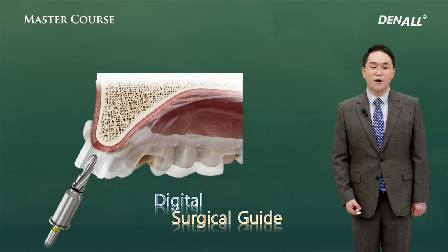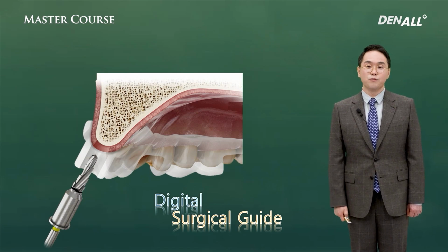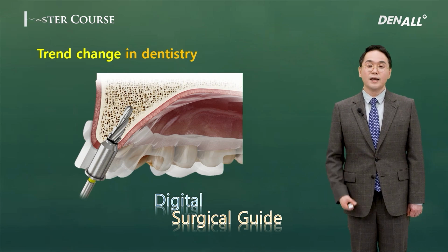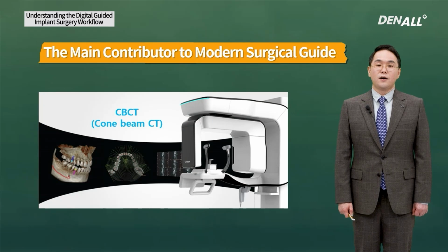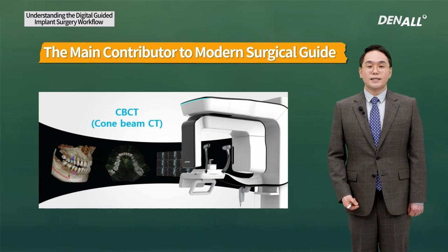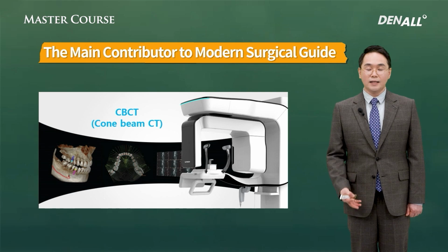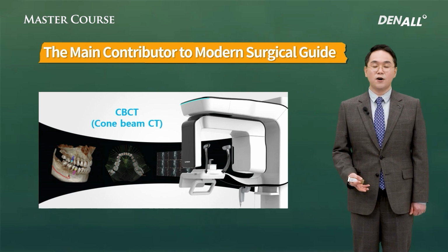Therefore, recently, as digital becomes the big trend in dentistry, digital surgical guides and digital guided implant surgery are getting very popular. In modern digital guided implant surgery, CBCT is the biggest contributor. With the widespread use of cone beam CT, digital guided surgery is enabled.